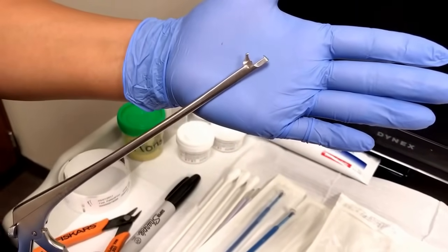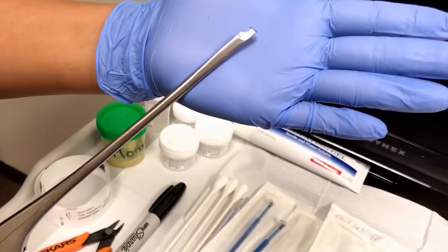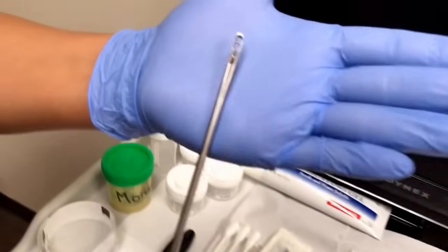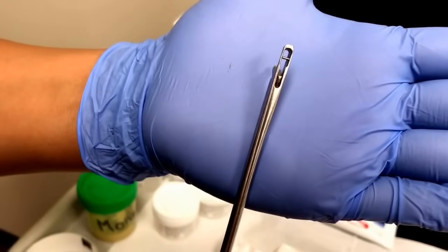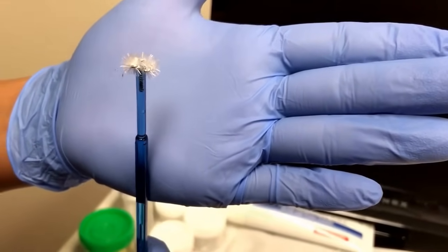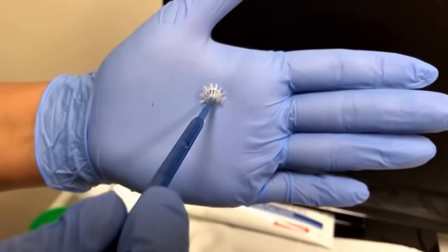The provider has two methods of obtaining a biopsy. This one here moves in this fashion, and the biopsy would then be collected in the bottom and shaken off into the vial. There is also this method here, which has bristle-like ends and would be used in this fashion onto the cervix.